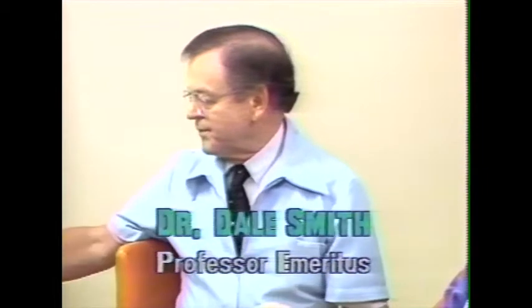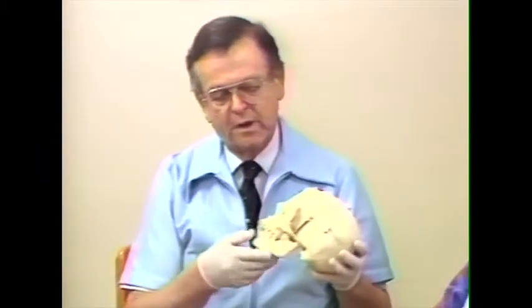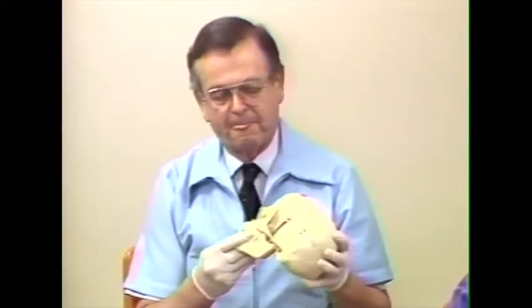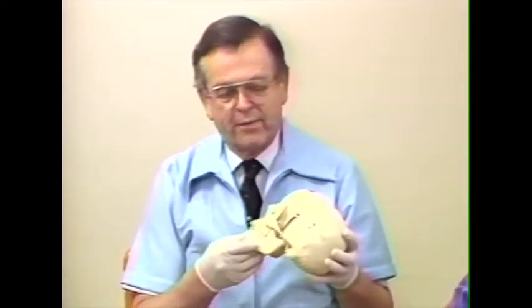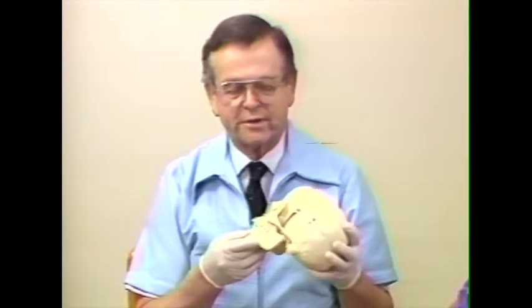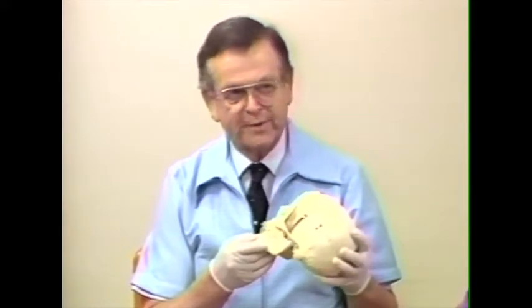The mandible can perform two types of movements. The first is a hinge movement. The second is a gliding or a translation. The hinge movement is the important one that we want to transfer to the articulator. If we can duplicate that, we can go a long way toward duplicating jaw movement.